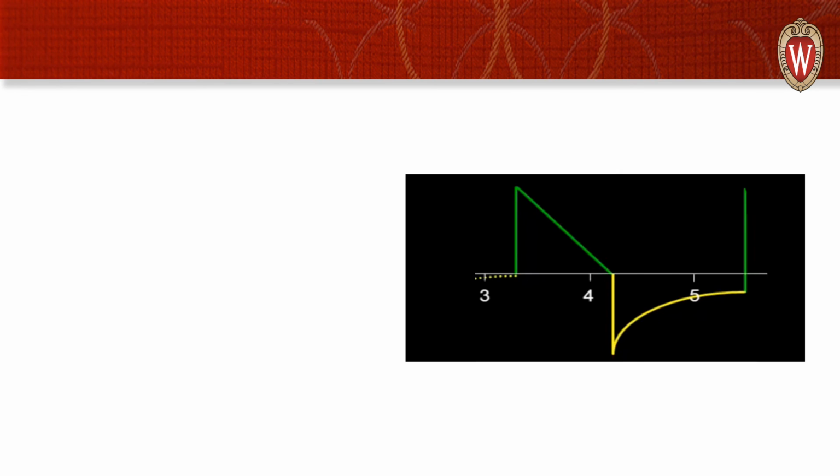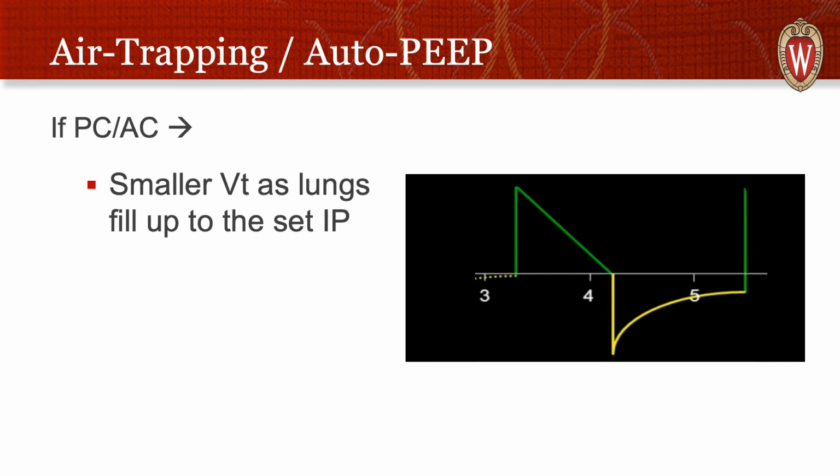The way that I'll do this is by showing pictures, pausing a moment or filling the space with some talking, and then trying to go through and identify the problem. This is a classic asynchrony problem that comes up on boards and other tests for physicians all around the country all the time in different fields. And it's a classic case of air trapping or auto-PEEPing.